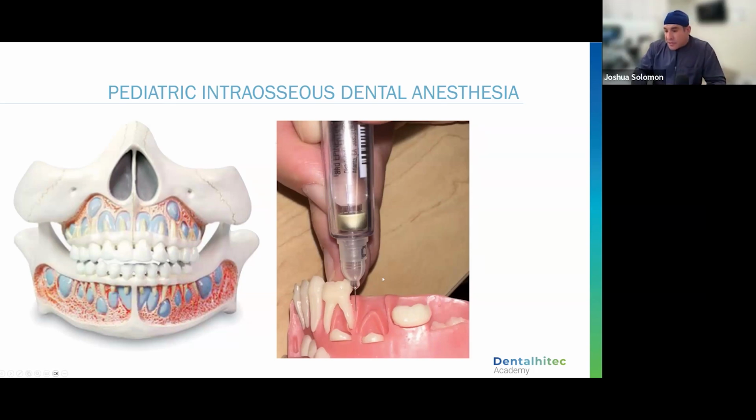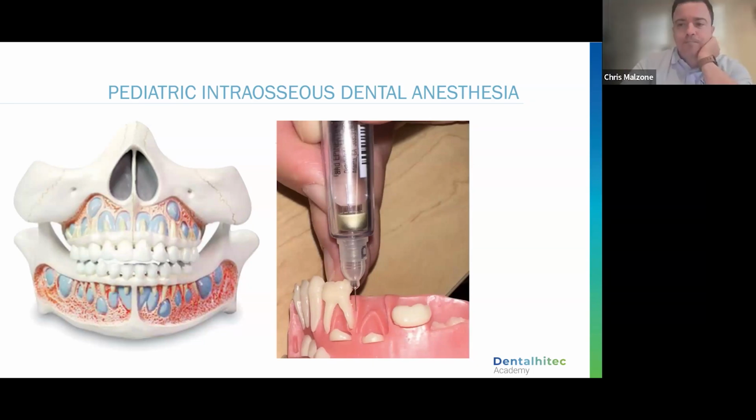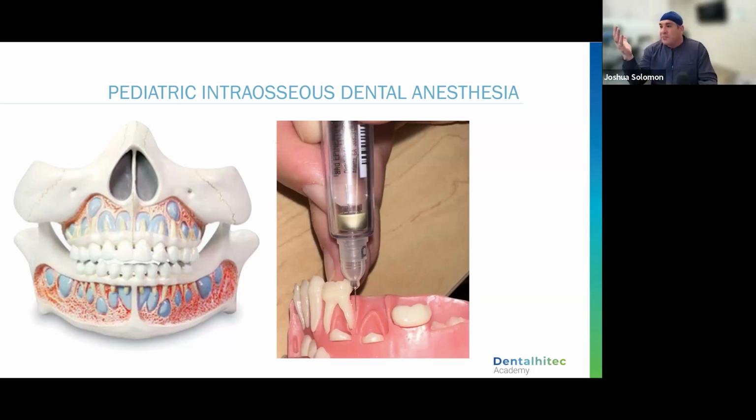For older patients, it does come with the longer needles, like both the 9 millimeter and Chris, I'm sorry, what's the 16 millimeter? 16, thank you. I don't even know, because I think I've used it once I got out of the box, and that's it. You can technically give a block with this, but really I've only used the 9 millimeters 99.9% of the time, okay?